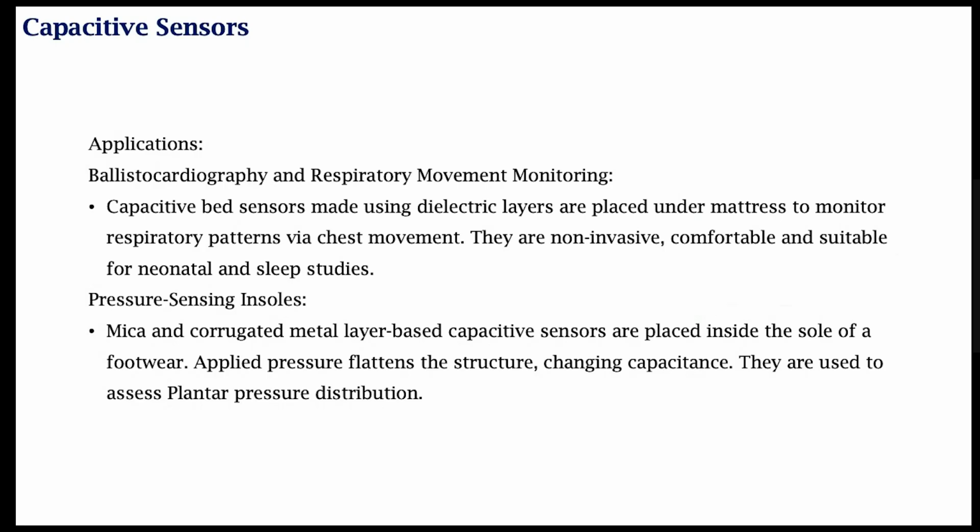It turns out that people's breathing patterns before, during, and after sleep vary, and there are signature patterns of breathing during sleep. Now it's useful to measure sleep patterns using breathing, and it's a non-invasive method to measure this.